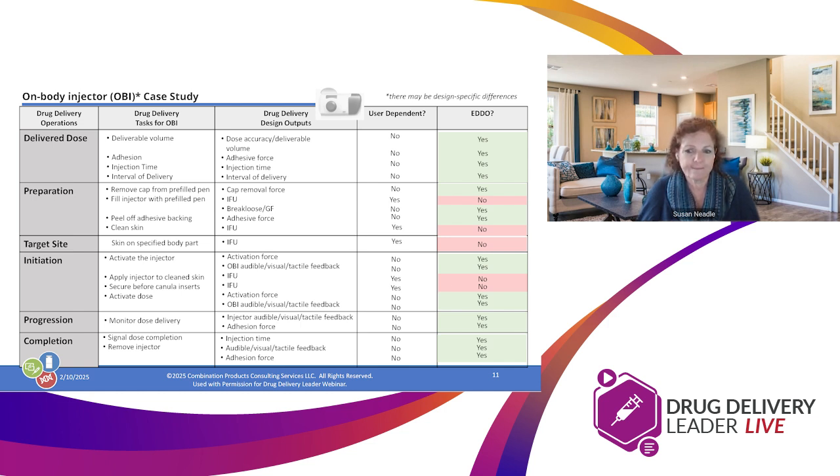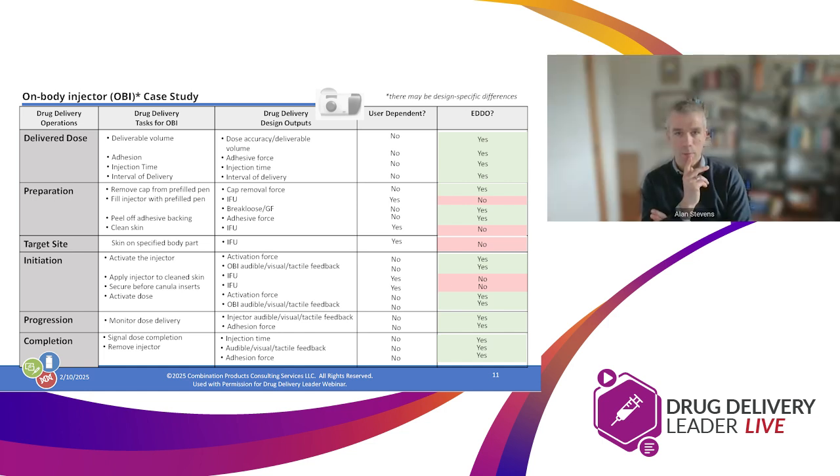Well, I'm just thinking out loud here. I mean, the cap removal, since that's up here on the screen, there's the interaction between the cap and the body of the injector, the actual force that's required to be applied to remove the cap. That is the specification that's actually described in the guidance as what the agency is looking at.